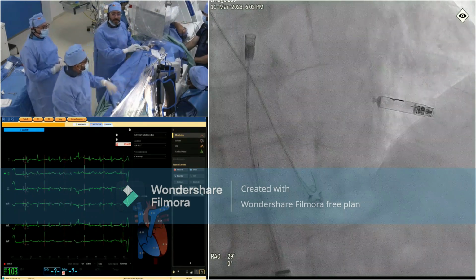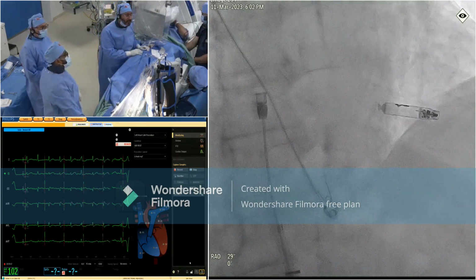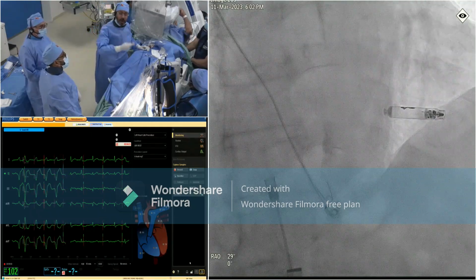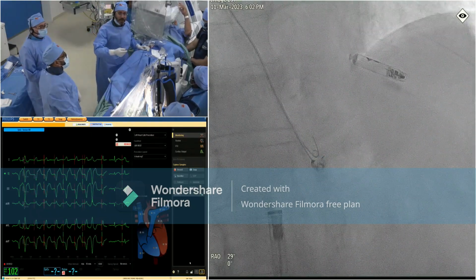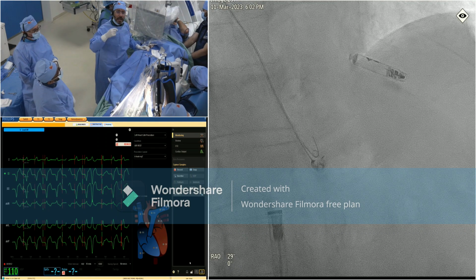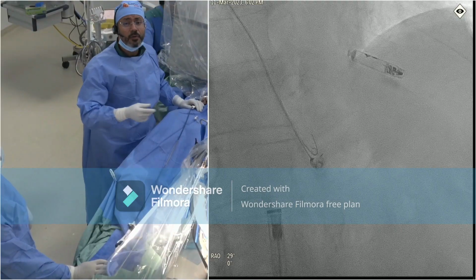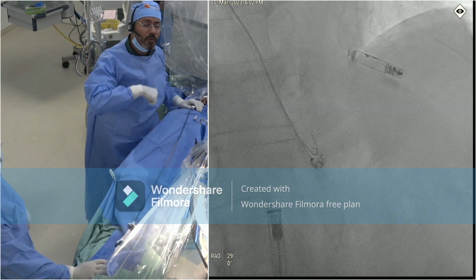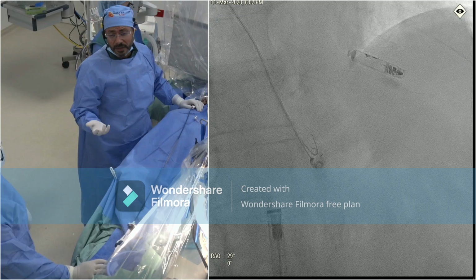We have to make sure the compression is not a lot to avoid DVT. And it's the same thing, we have to monitor the patient by two things in the morning. Programming of the device to make sure that the stability of the parameters is good. They are doing testing again now. And at the same time, after the programming, we do echo to make sure that there is no effusion now, and tomorrow morning, if everything is good, we can discharge the patient.